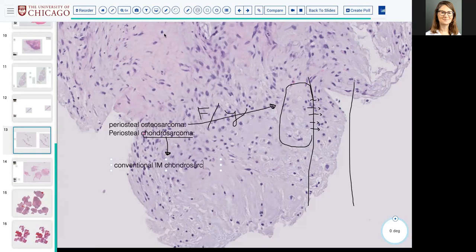In this case, you're dealing with something that perhaps originates in the bone and then has outward extension into the soft tissue. Where the tumor is centered and how it's getting there is very much a discussion you should have with the radiologist, because when you look at just this, it's very challenging.